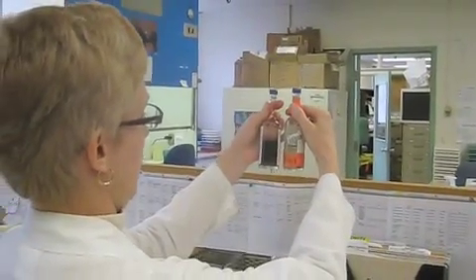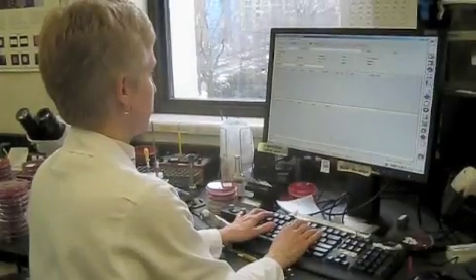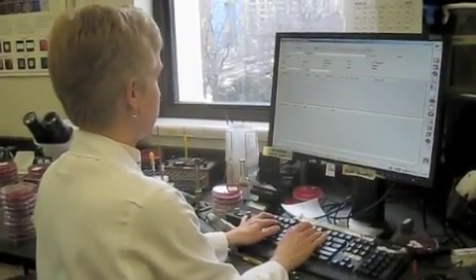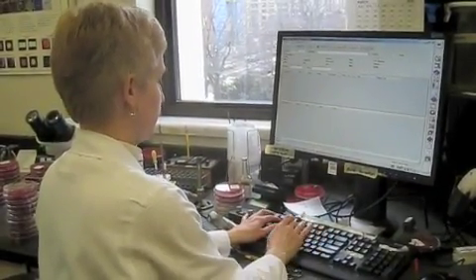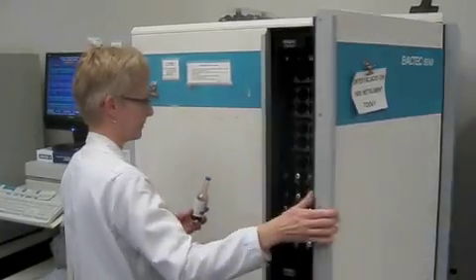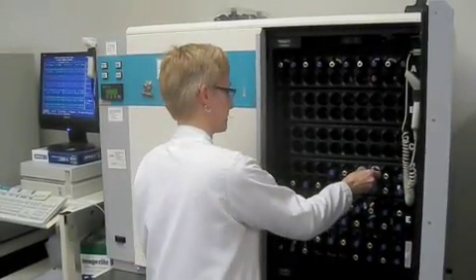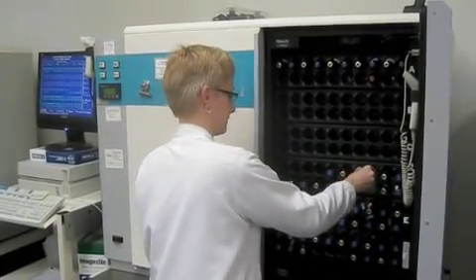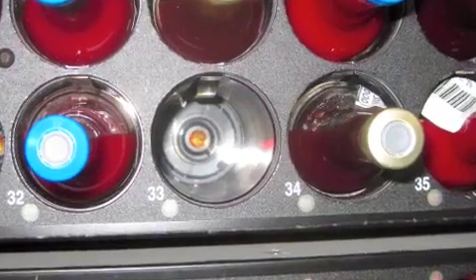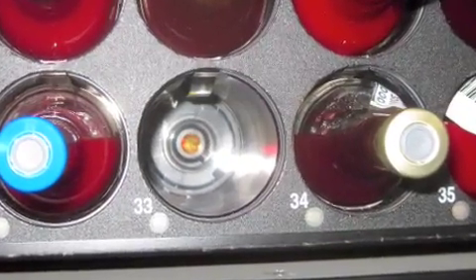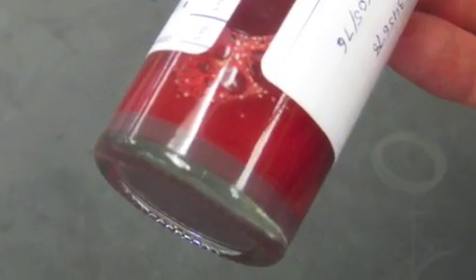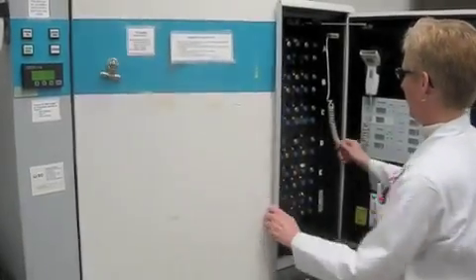In the lab, adequate volumes are confirmed and the request is entered into the lab computer system. Cultures are incubated at 35 degrees Celsius. The instrument regularly scans the vials for CO2 production, measured by fluorescent activity of culture medium components. If a threshold is reached, an alarm sounds and the vial is removed for further processing.